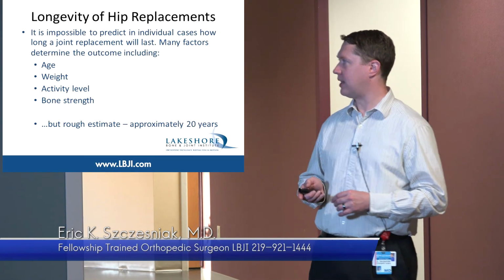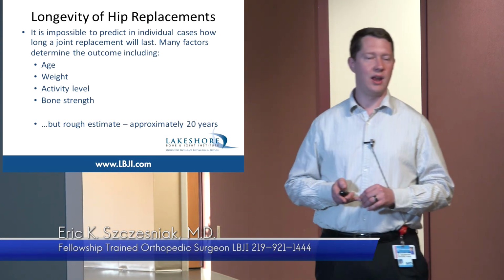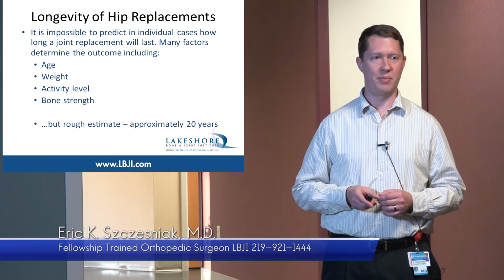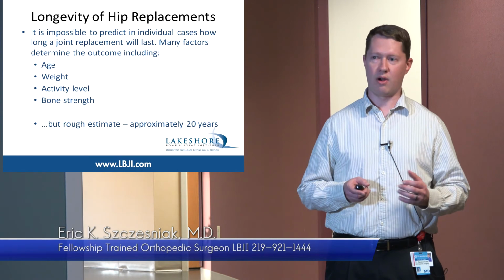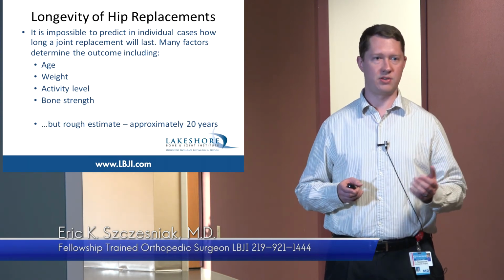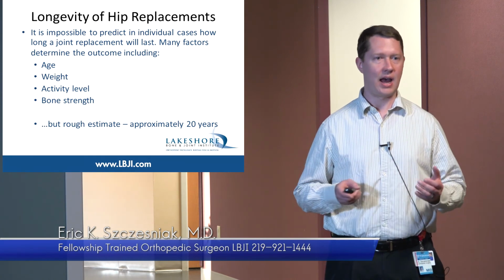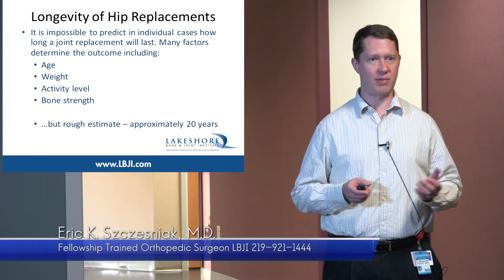Longevity I've already touched on a little bit. We quote 20 years, but this is a little bit variable as well. In particular, the biggest variable with this is the younger you are, typically the more you use your hip replacement. So it's been shown to wear a little bit quicker in younger people. This does not mean half the time. This means that it changes things by a couple of years.